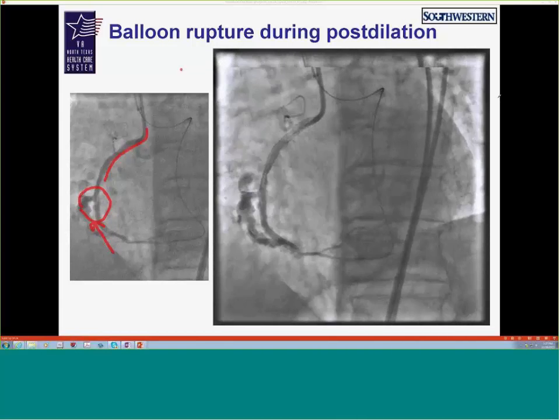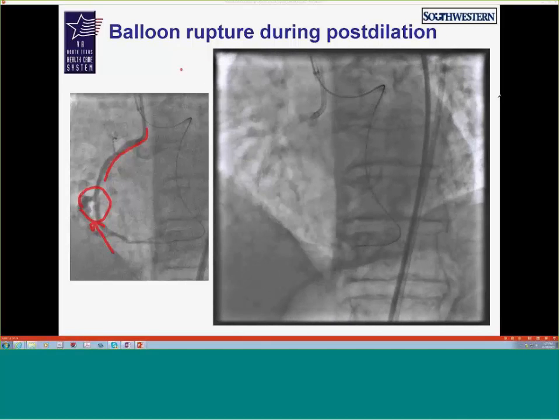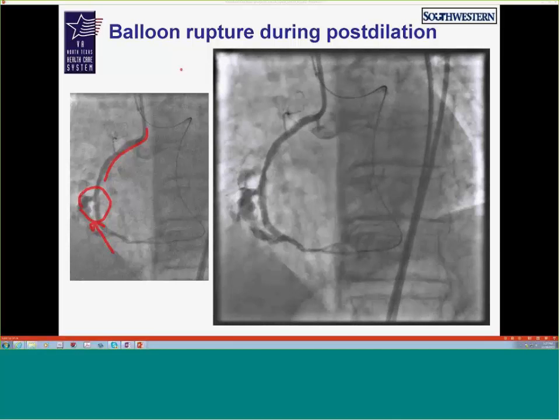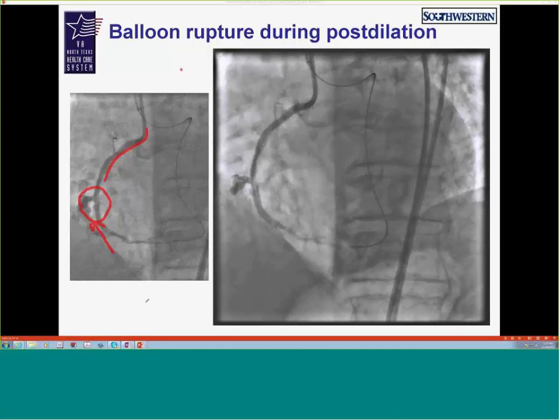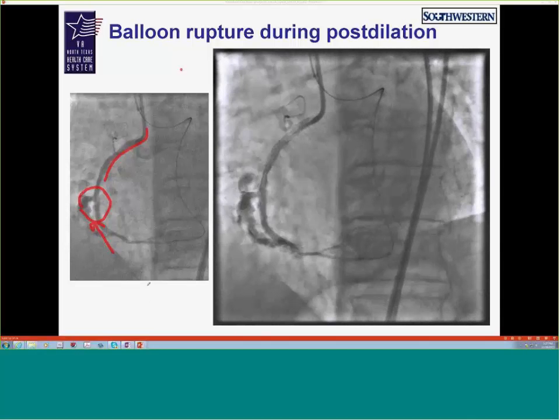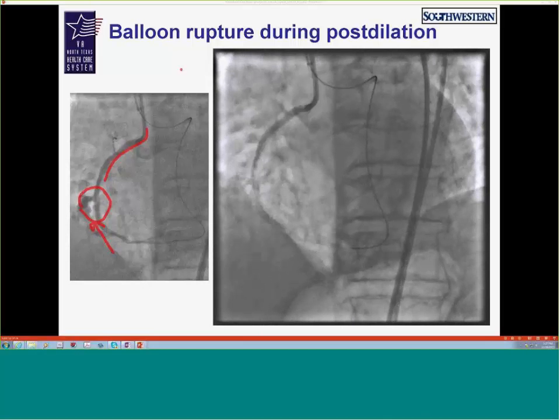And then the neck is wide, so the concern there will be, will the coils want to come back towards the struts, the main vessel? Yeah, except that you have a stent there. True. And then I guess, actually we did end up putting another stent. I can put another stent, just double jail it or something like that. Yeah.